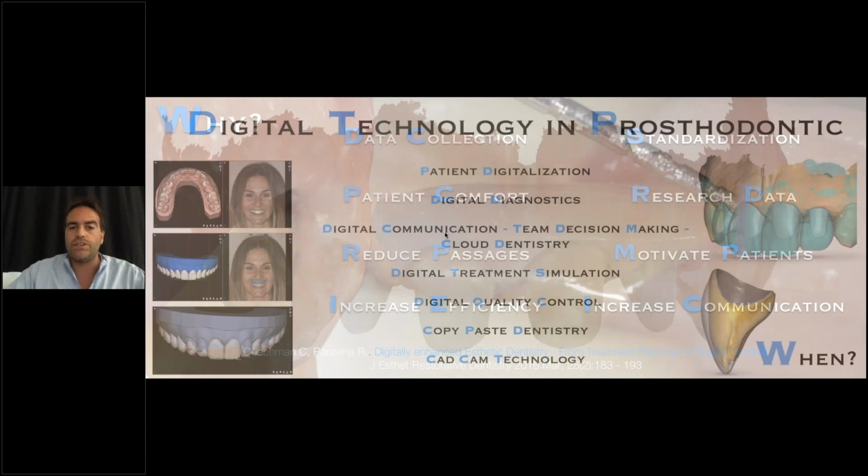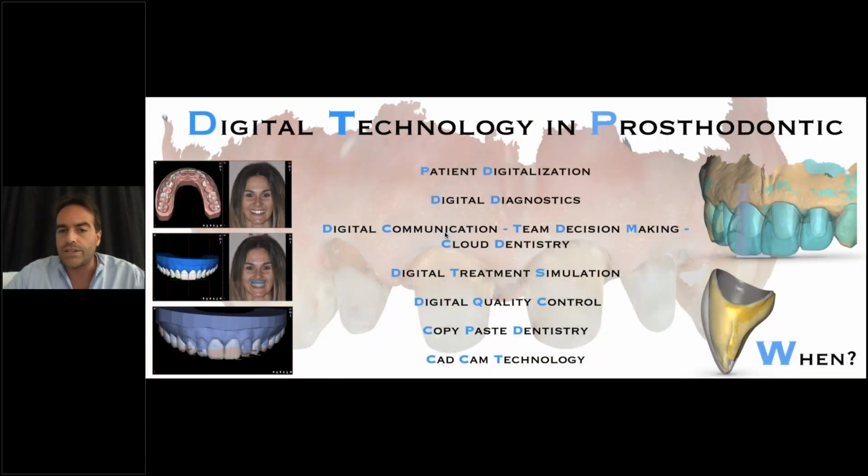And when digital technologies enter in the prosthetic workflow, well, we were discussing data collection, so we can digitalize the patient from the very beginning, and then we can utilize the digital pictures, the digital intraoral scanner to create a digital diagnostic workflow, which is extremely powerful, not only for communication with the patient but also in team decision making with all the components of our dental team. We can simulate dental treatment.